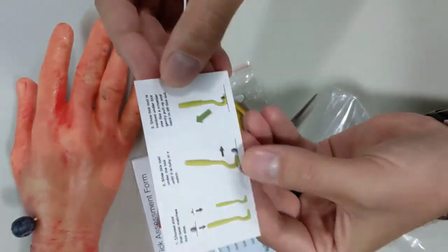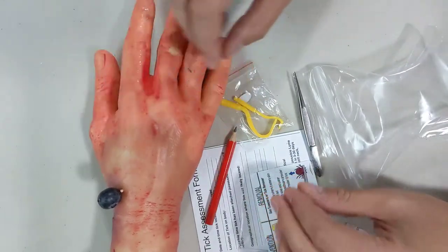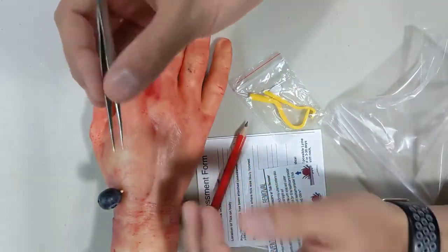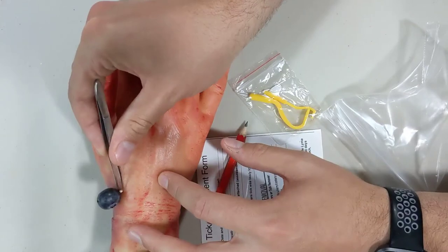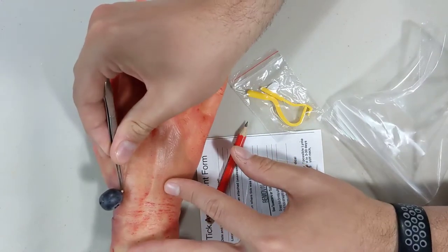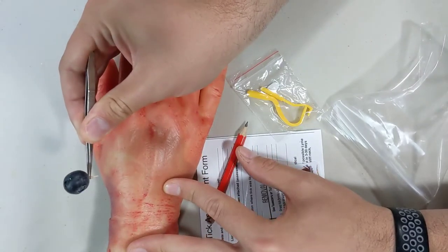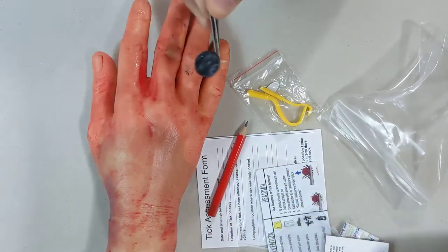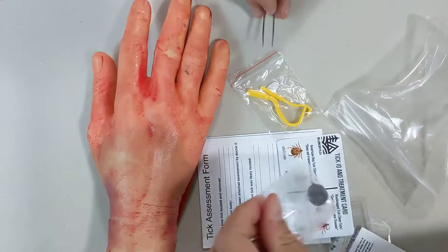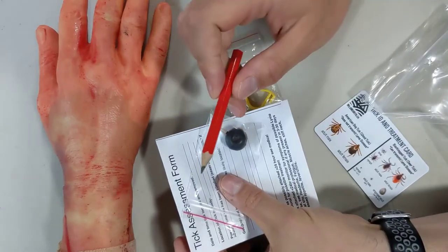Here is the instruction card for the tick removal tool. Using a fake tick for demonstration — the big thing with tick removal is to try to get the entire tick out in one piece. Get nice and close to the skin with either fine tip tweezers or your tick removal tools, grasp it firmly, and then pull with nice steady force until the whole thing comes out. Then place it in your tick bag, fill out your form, and take these with you to the doctor for potential treatment.